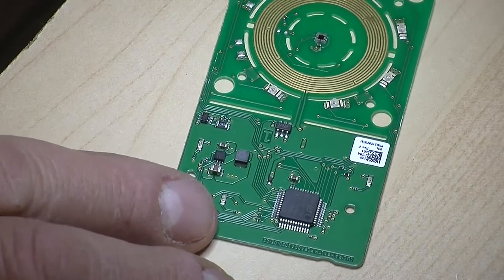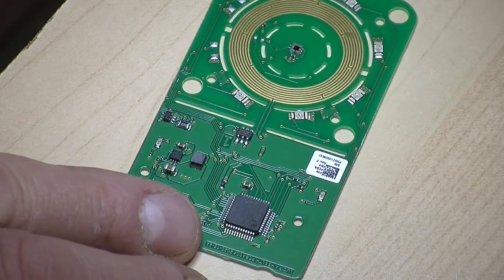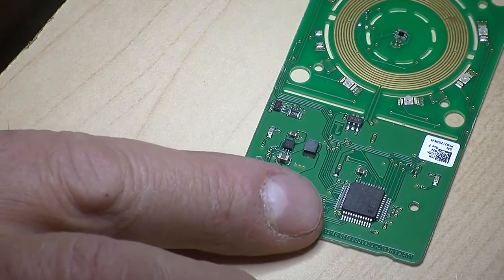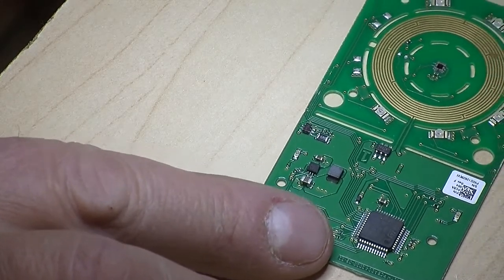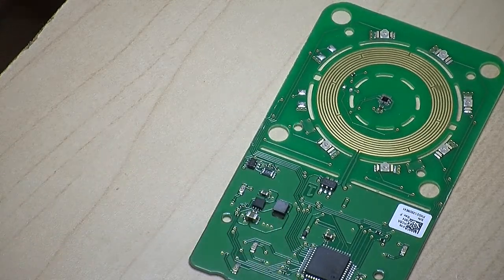Is there anything else of interest here? Well, obviously some sort of a digital code to help follow the thing through manufacturing, and a bunch of miscellaneous other little integrated circuits and LEDs. All in all, not a bad circuit board at all.